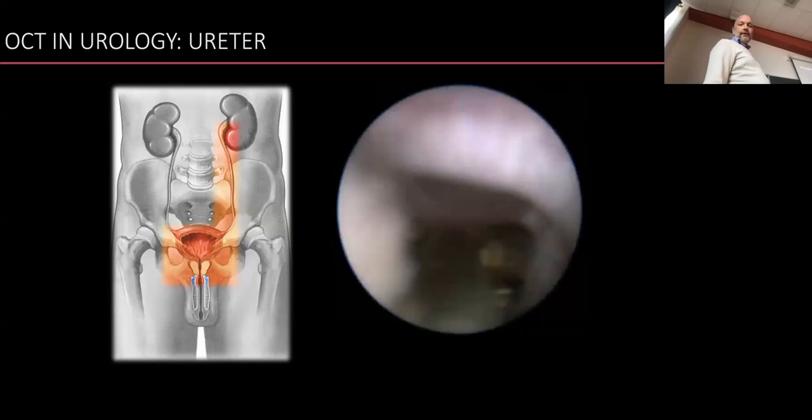What we usually do there, now the movie doesn't want to play, but what you see here is an endoscopic image of this tract. You can go in with an endoscope through the urethra into the bladder, into the ureter, and study this whole inner lumen. When you see a lesion growing because a patient came in with blood or whatever, you want to study that, you can take a biopsy. A tiny tool goes in there and takes a piece of tissue, with what we call a biopsy forceps.